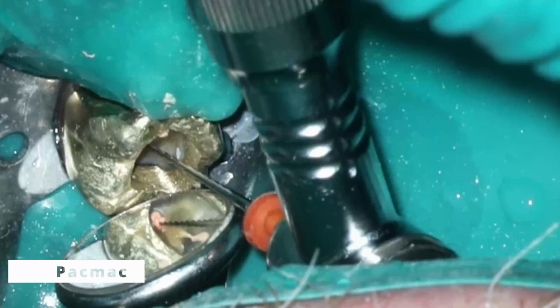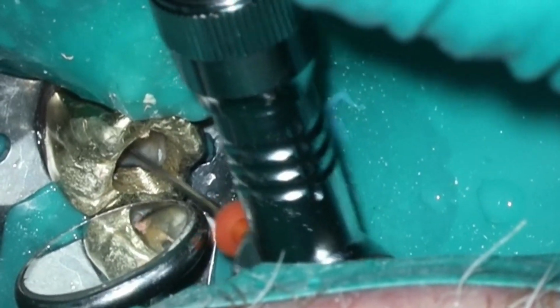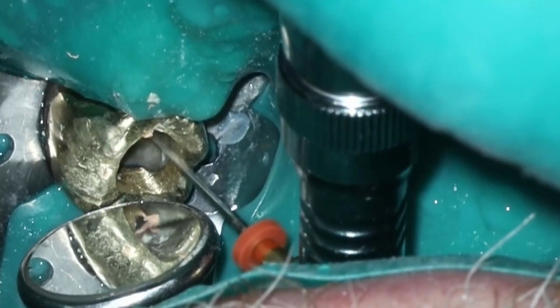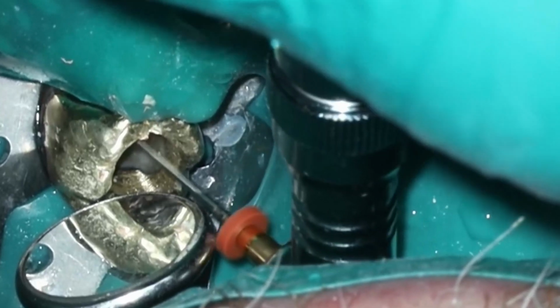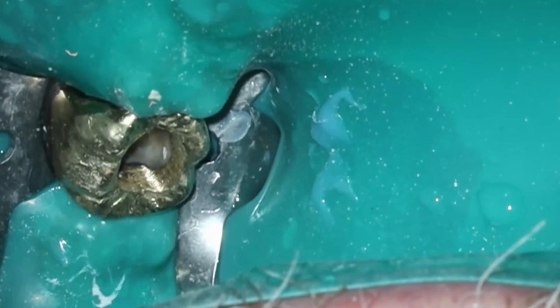So what we're going to do is PacMac these, like always, with skinny canals, even though they were able to get down a little bit of the canals, they were still pretty small shapes, and PacMac just helps make sure everything is well sealed up. I'm happy to say he didn't have any issues with pain during the obturation, so the only issues were really at the beginning, unfortunately. And that's something you do see sometimes with pulpotomies, is that it makes the pulp really inflamed if you don't put enough calcium hydroxide in there, and that's I think what happened here.